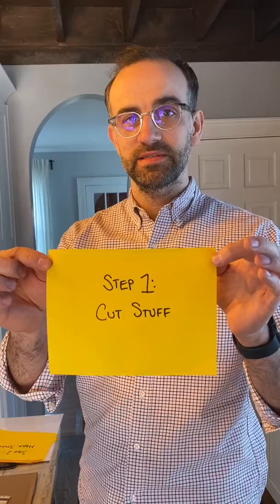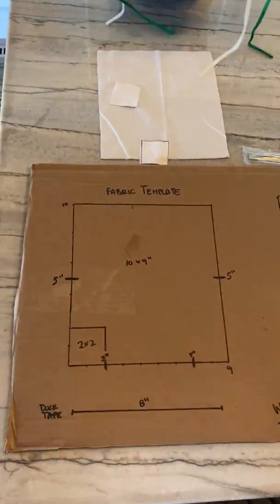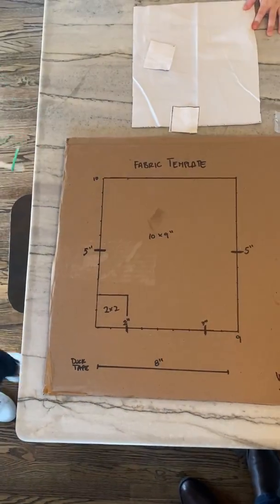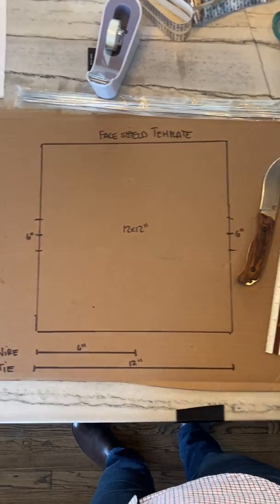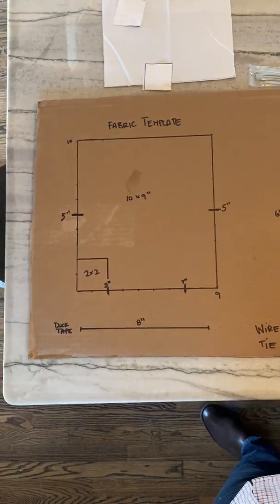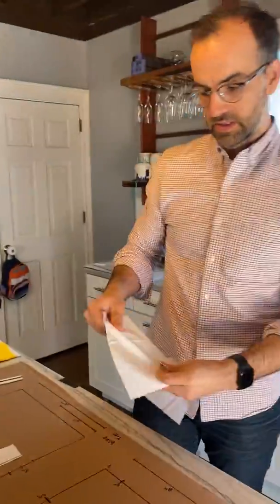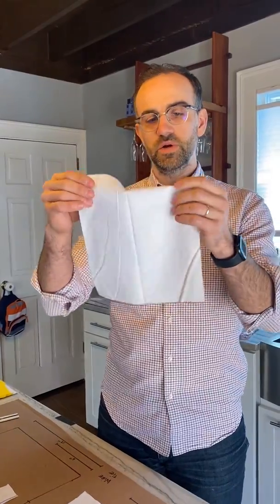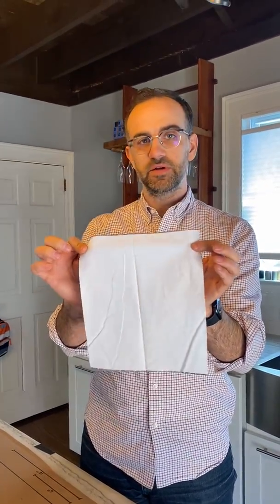Step one is cut stuff. The easiest way to make sure everything is cut the same every time is just like Everett's showing — create a template out of a piece of cardboard. With Amazon, we all probably have lots of cardboard around. You'll need a 9-inch by 10-inch piece of 100% cotton fabric; I just use premium muslin fabric which I got at a local fabric store. You can see it fits nicely in our square here.